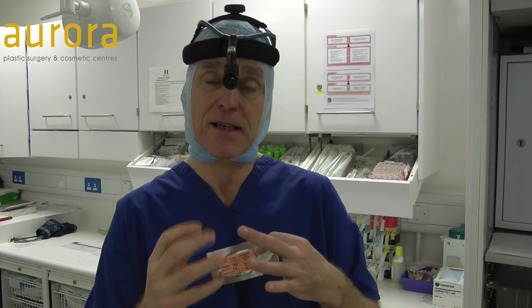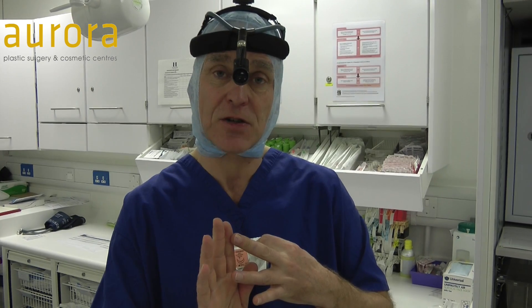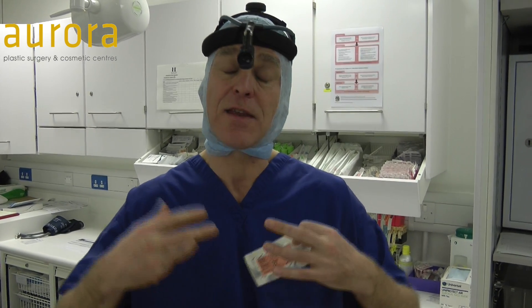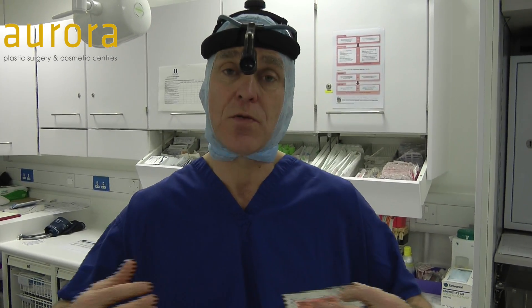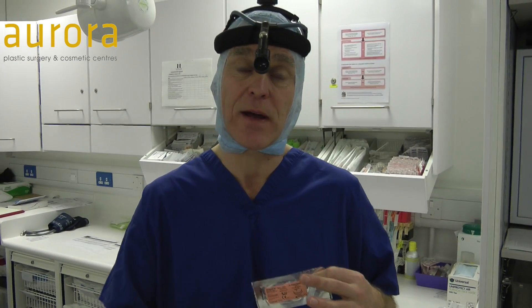So for a plastic surgeon, you can get the skin really nicely together, pull it to just exactly the right tension and then relax. And unlike other stitches, it won't relax, so the skin won't part again. In effect, you're locking the stitch every time you do it.